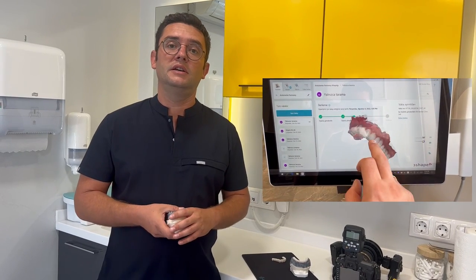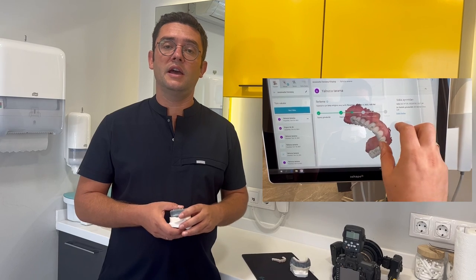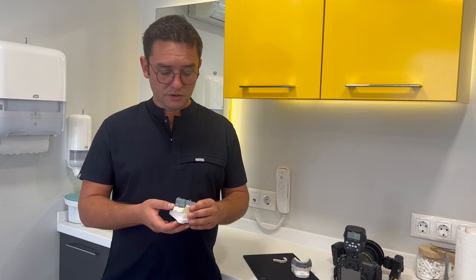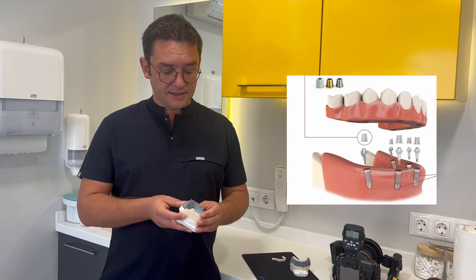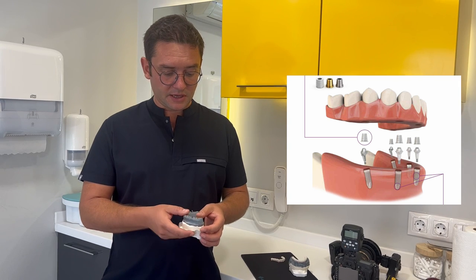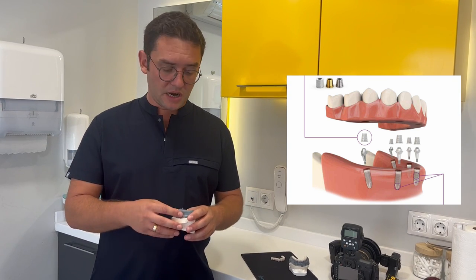We take the impression, design the teeth digitally, and check the design in her mouth to see how the teeth will look. Then we produce the crowns from zirconia material. Our implant system has a hybrid coping which enables us to make these digitally produced crowns, because not all implant systems unfortunately have this ability.